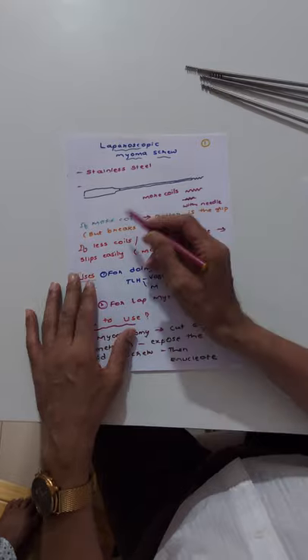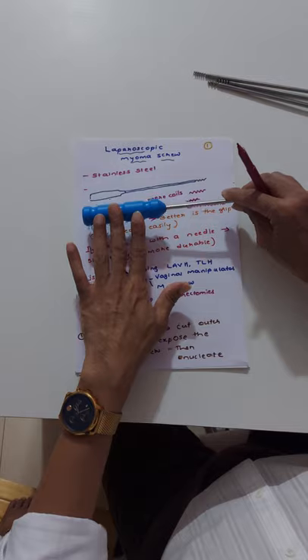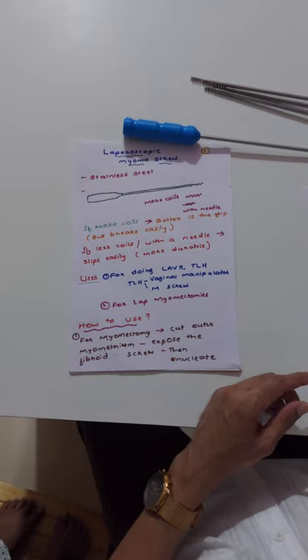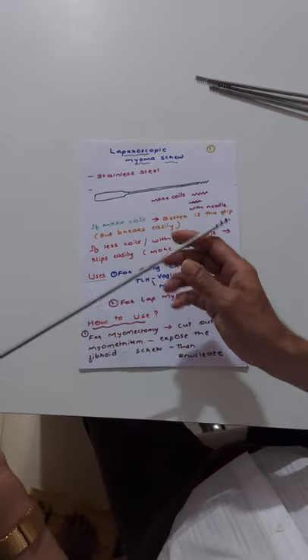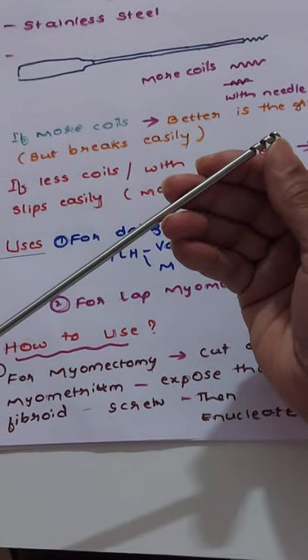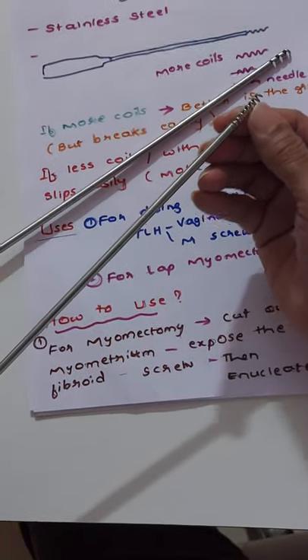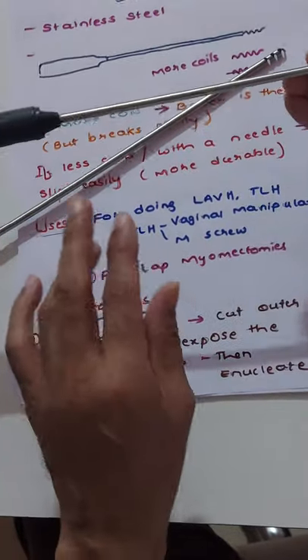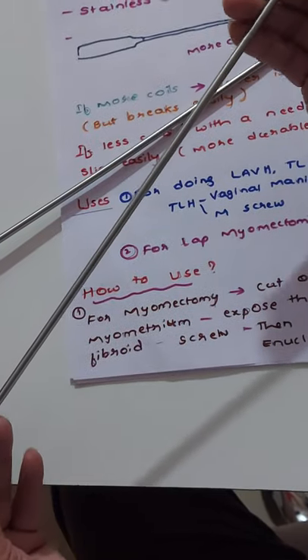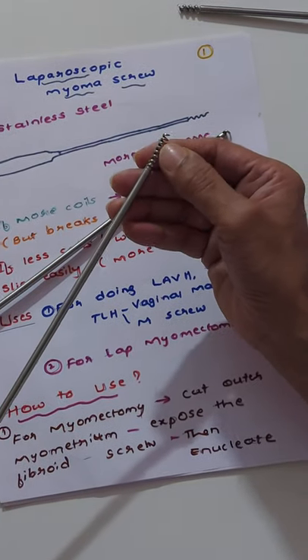I will show some screws here. Most of the time they are made of stainless steel; only the handle is somewhat plastic. There will be some minor differences in the tip. You can see here — there are only two turns on one, and on another there are multiple coils. The screw has three parts: the handle, the shaft, and the screw tip. The screw can have multiple turns or minimal coils.